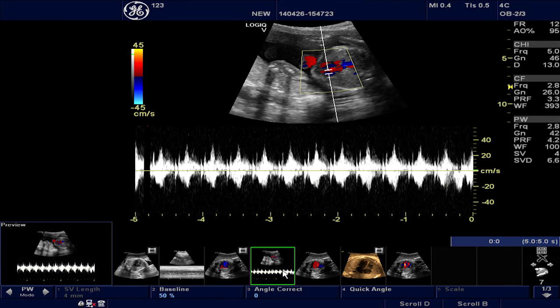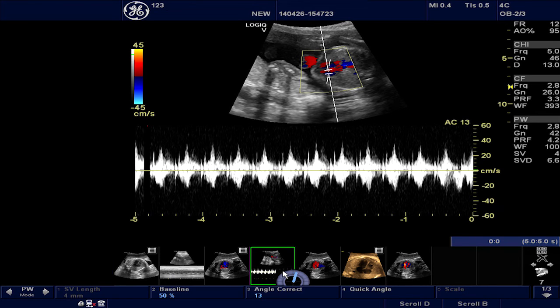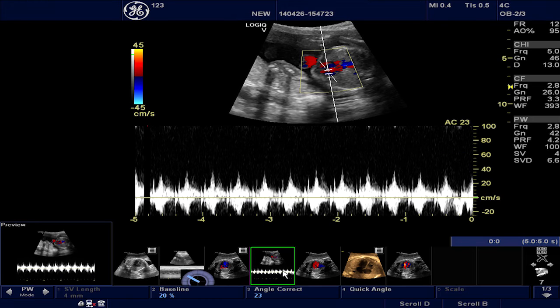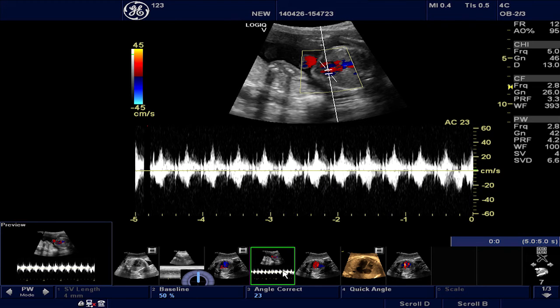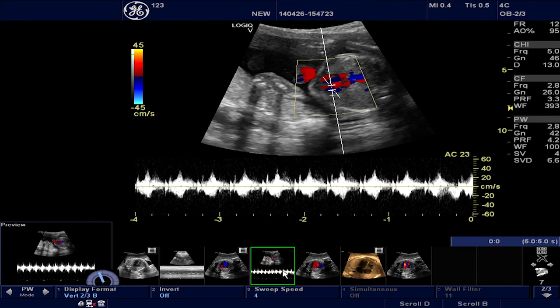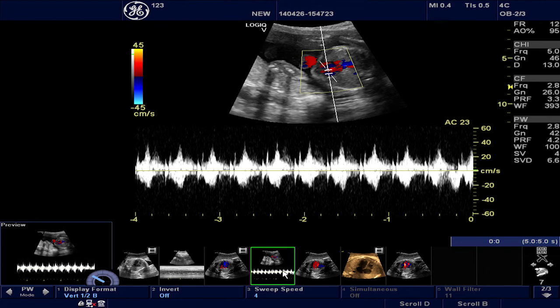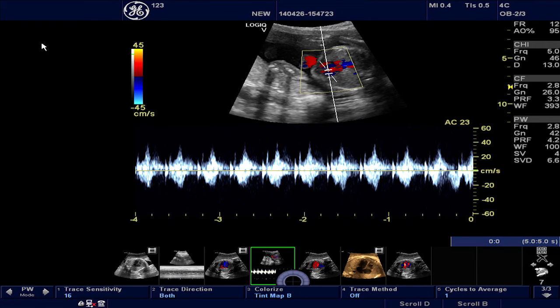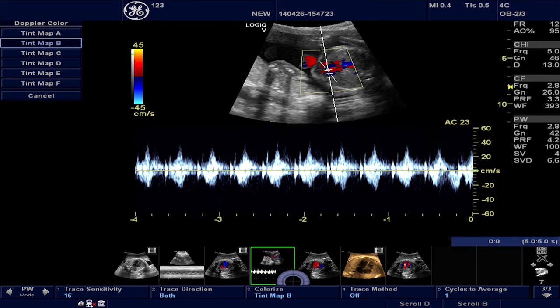This is a recalled fetal heart Doppler tracing image. We now obtain a PW Spectrum and then freeze. Store the image obtained. Use the AngleCorrect function to optimize the angle between the Doppler cursor and the vessel, so as to give you a velocity measurement. You could also adjust the baseline, sweep speed, and the display format to customize the spectral display. The spectrum image quality can be further adjusted by using the post-processing controls of Colorize.